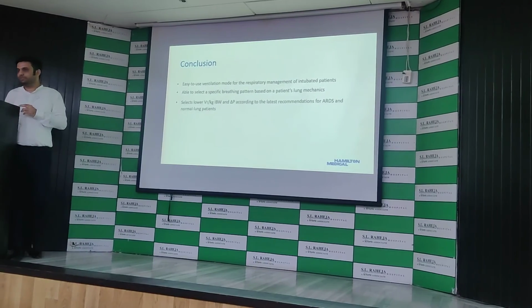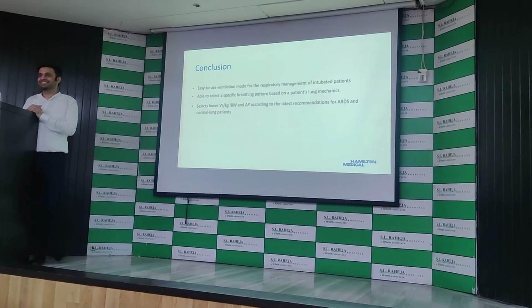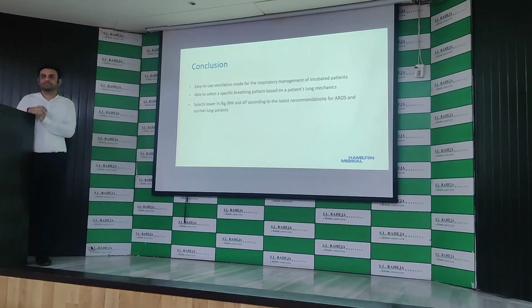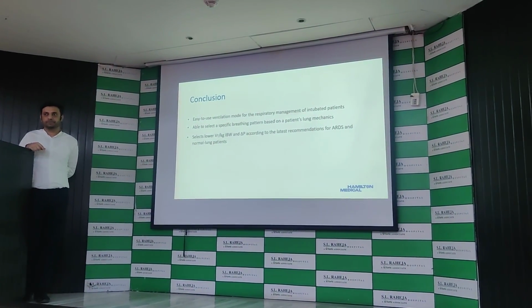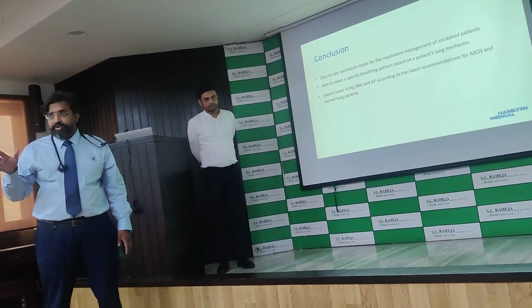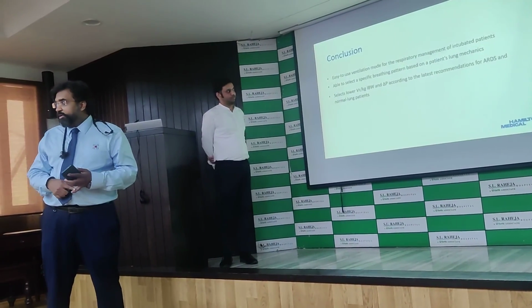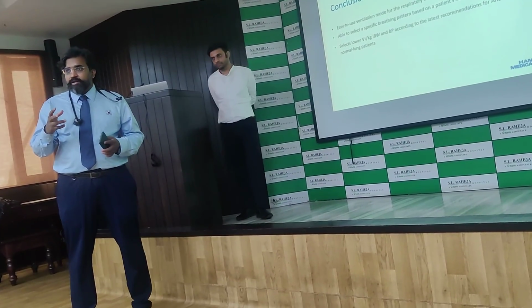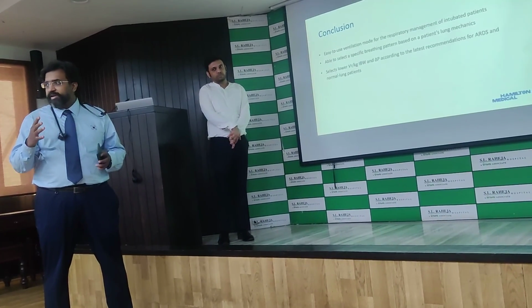So I'm actually very happy that Siddharth and Akash came to put that ventilator there, because it's not just the use of the ventilator, it's also understanding physiology. By understanding this mode, there's a lot of physiology that we've understood here today. If you see, we've understood time constants, we've understood a few things in physiology that make a big difference here. And so each ventilator, don't take it that it's just a super class ventilator like that. It also gives you a lot of physiology understanding.